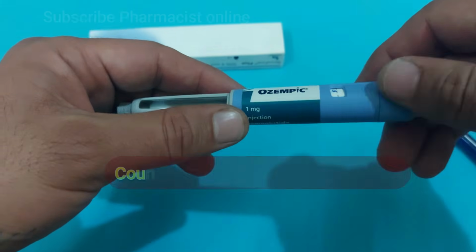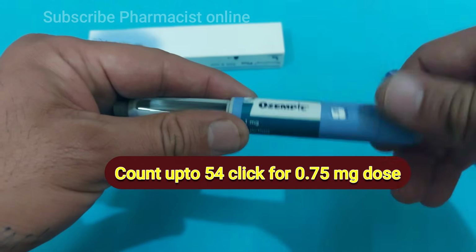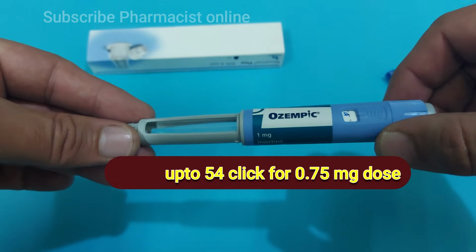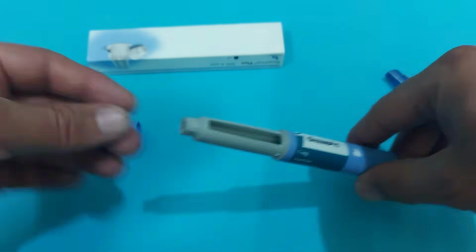The same way, if you need 0.75 milligram, add 18 more clicks. That will be your 0.75 milligram dose. For more detail, please check the description. Plus, let me show you here.